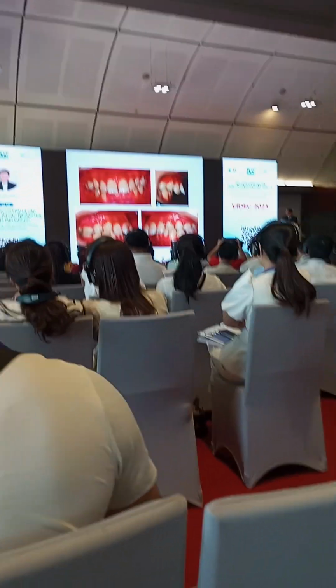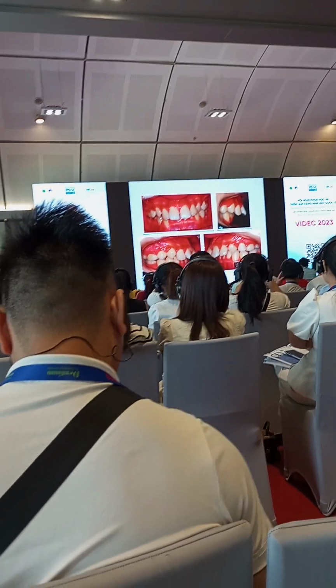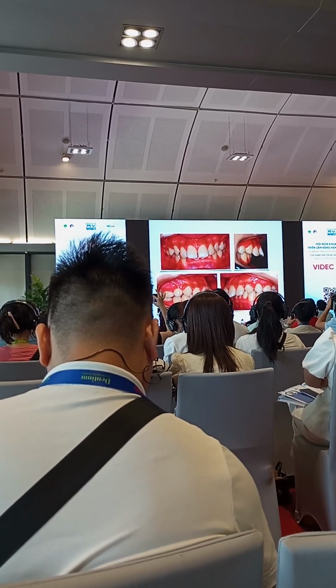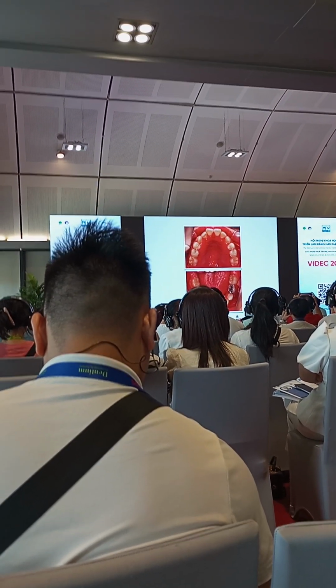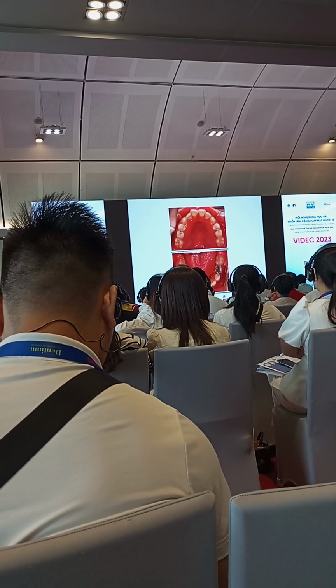Intraorally, you can see a full 100% deep bite, a big overjet of around 15 millimeters. You get a full class 2 canine relationship. Molars are also in class 2. There's still the deciduous dentition on the second deciduous molars, what we call the E, so it's still not yet erupted.